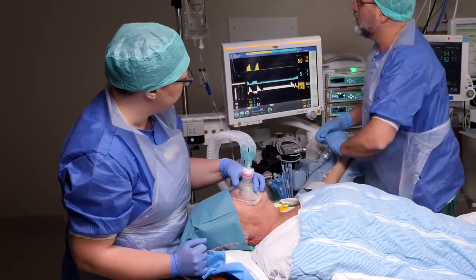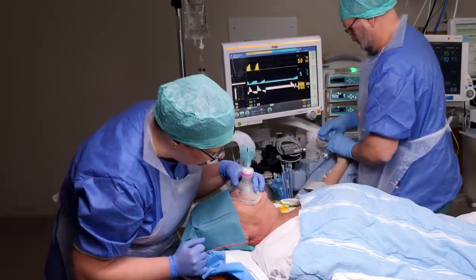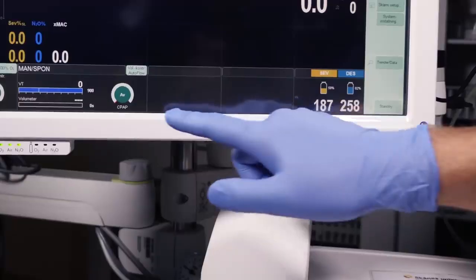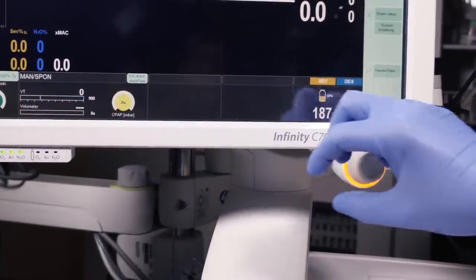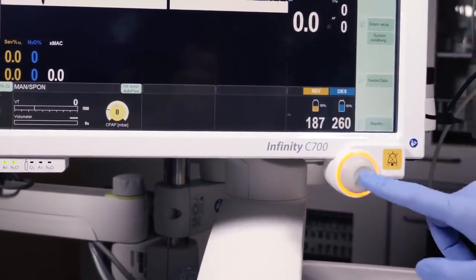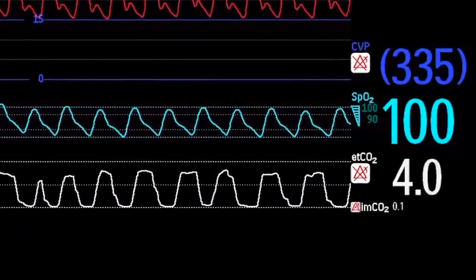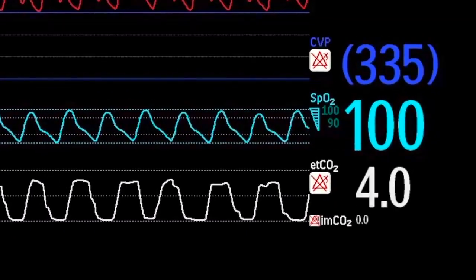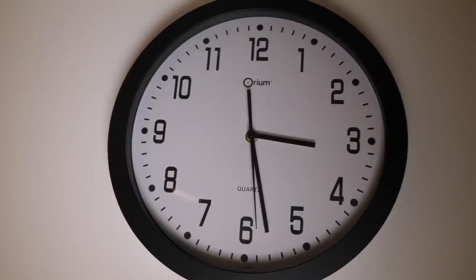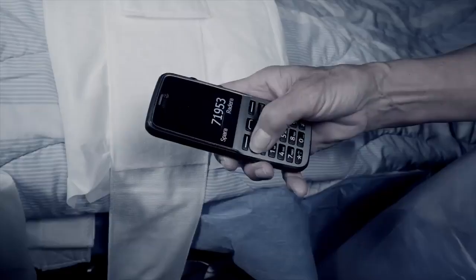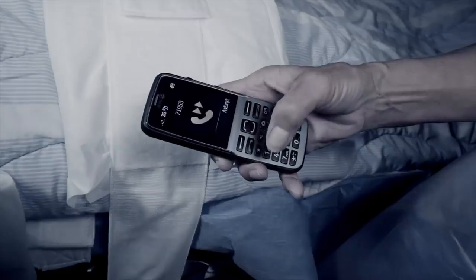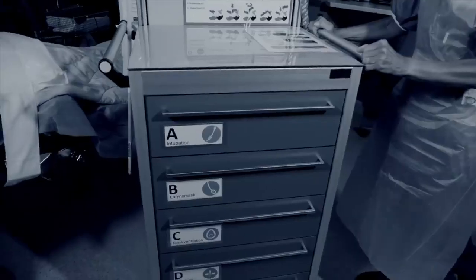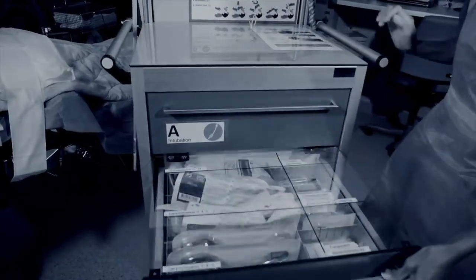Pre-oxygenation can be further improved, especially in the obese, by tilting the table and by applying a positive end-expiratory pressure. This extra oxygen in the patient buys you potentially life-saving time if you have unexpected airway difficulties — precious time to call for help or try more advanced techniques.